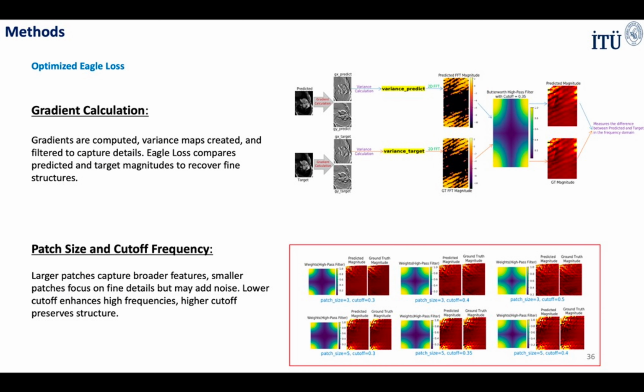The dataset consists of multiple CMR modalities, including aorta, cine, mapping, and tagging, with each modality presenting different sizes. The dataset was divided into 11 groups based on these modality-specific dimensions to facilitate the training process. Each modality group has its own training setup, allowing for more precise control over batch size during training. This division ensures that the model can handle the different modalities efficiently.